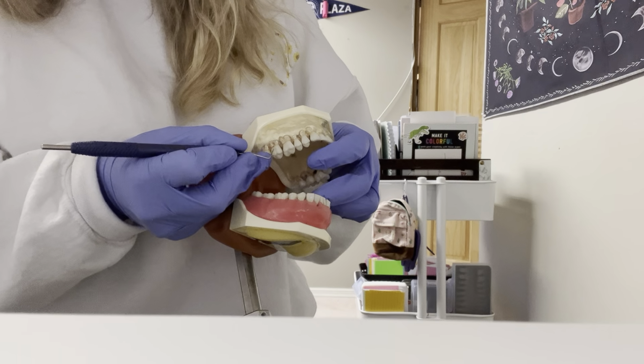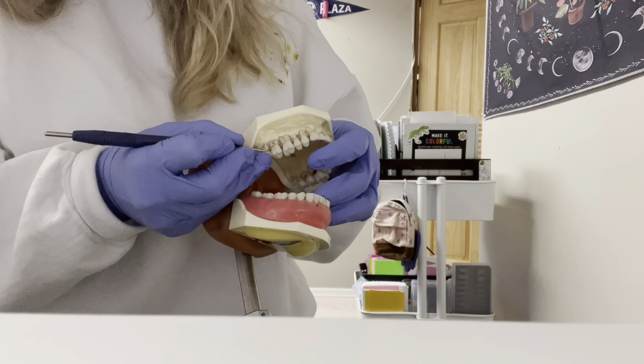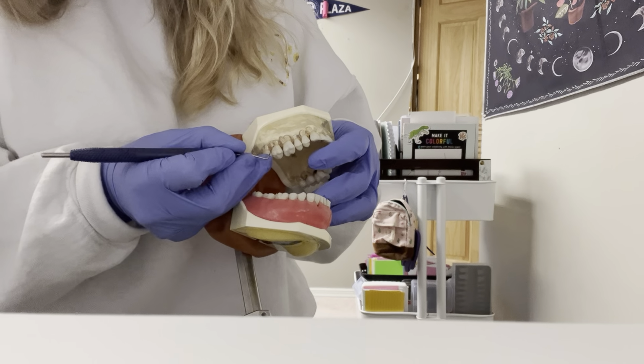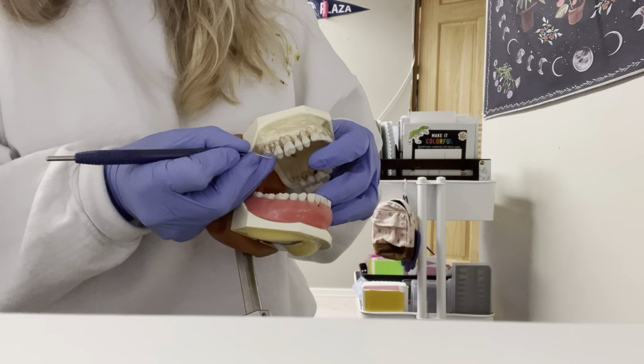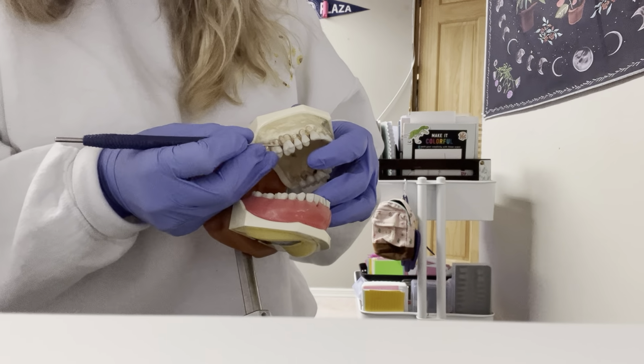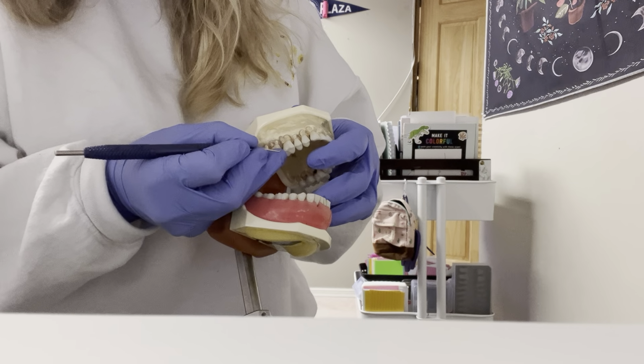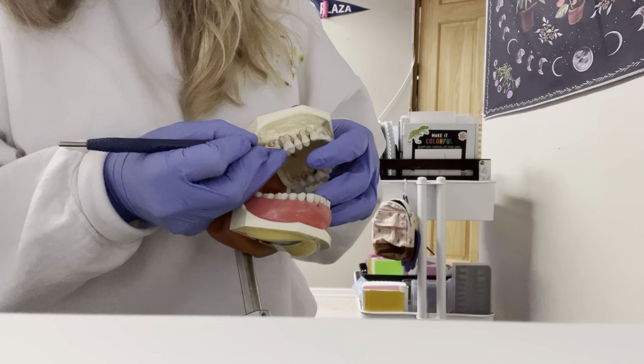So we're going to go to tooth number 2. Always end on an angle. End on an angle again. And at an angle.